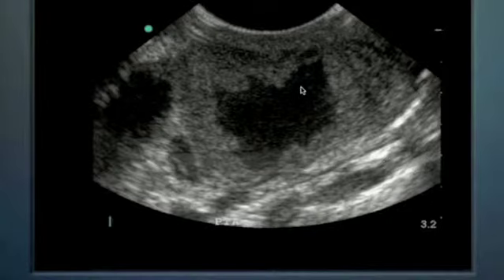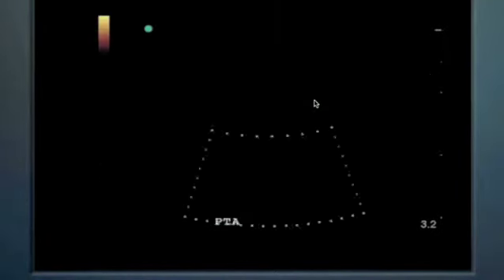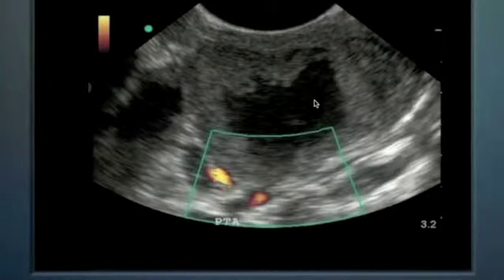You think about that, it's a very large one here, very prominent, and this is the intracavitary transducer we have in the mouth, and we can see that's a very prominent peritonsillar abscess here. One of the other interesting findings is when we apply color Doppler back here, we can actually make out that there are some blood vessels back here that we want to stay away from when performing the procedure.